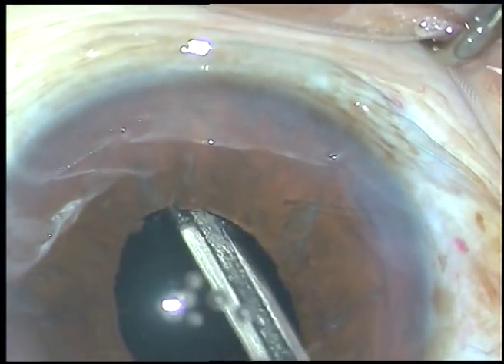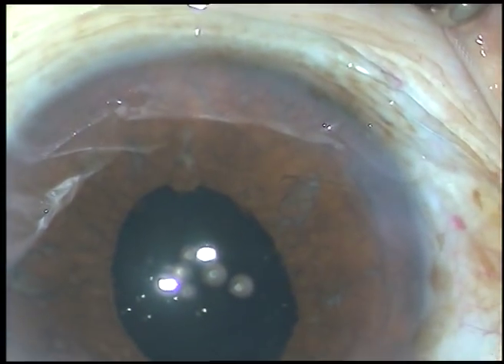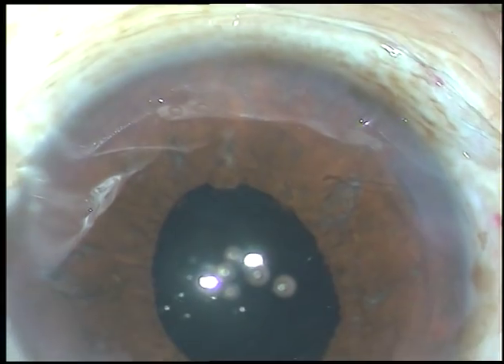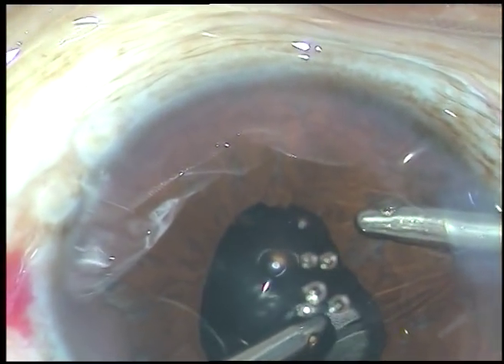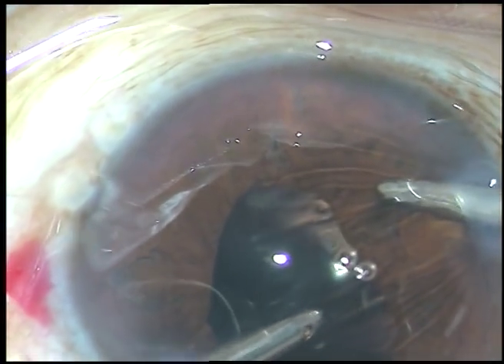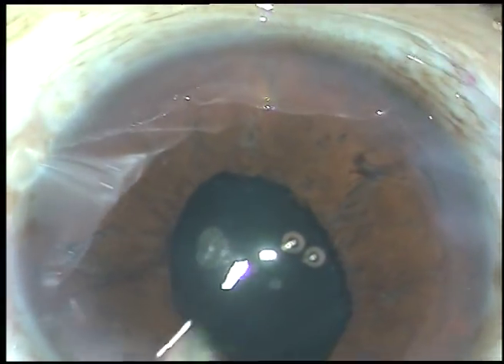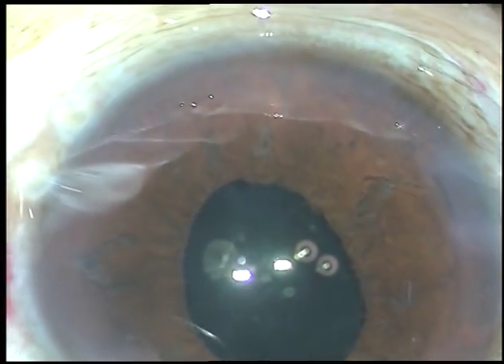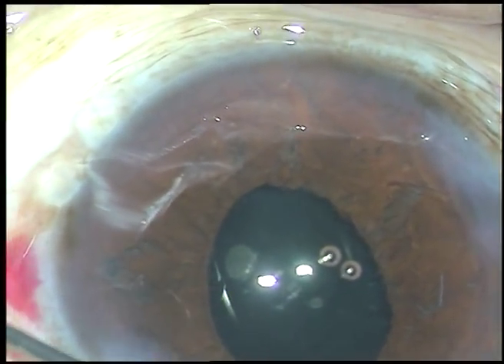Now the viscoelastic substance which was used for implantation of the intraocular lens is being thoroughly removed. Thorough removal of viscoelastic substance is mandatory — if you don't remove it nicely, the patient will have raised intraocular pressure, steamy corneal edema, and pain in the night, and may express a lot of grief to you next day. So to see the happy face of the patient next day, please clean the viscoelastic substance nicely.